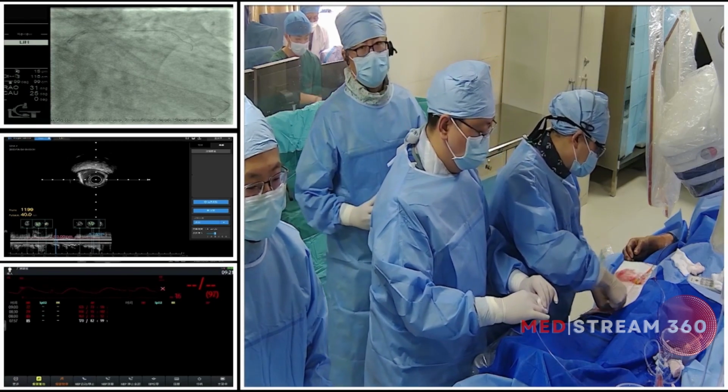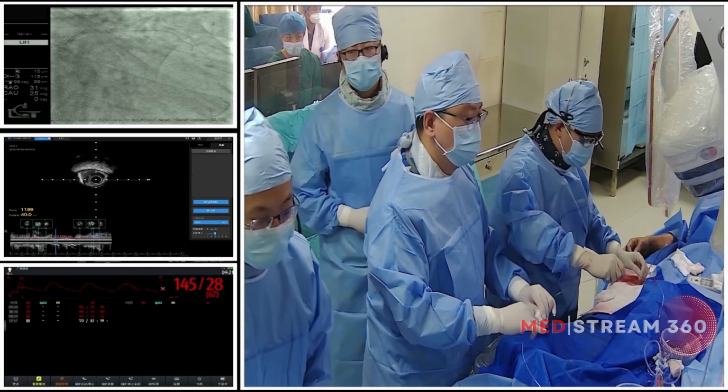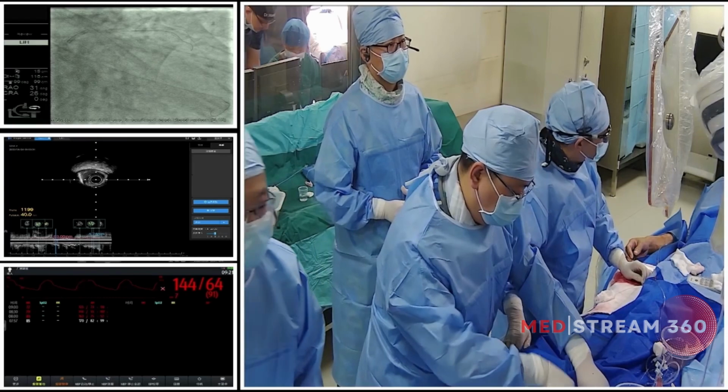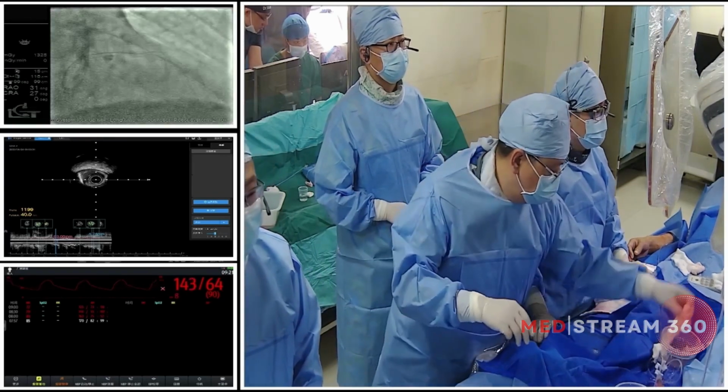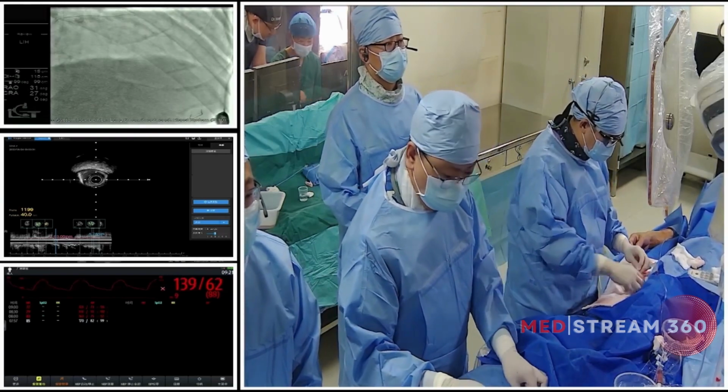I think our enemy is the calcification. So first, Dr. Zhao will introduce the case. Good morning, everyone. This patient is a 63-year-old male whose chief complaint is paroxysmal dyspnea for 3 months.